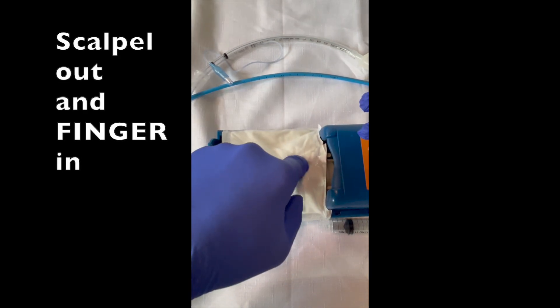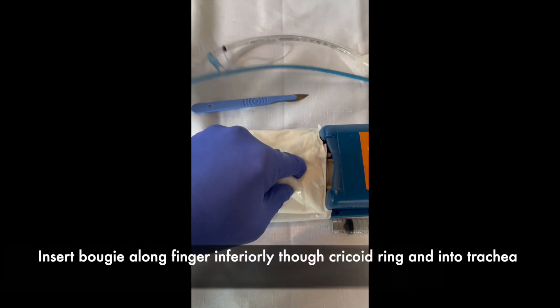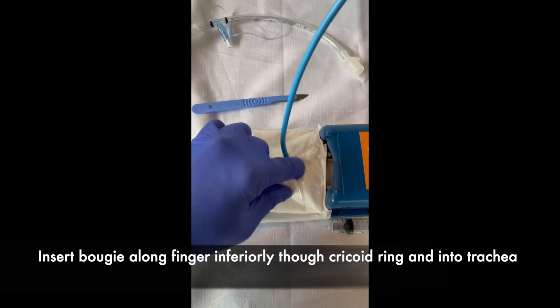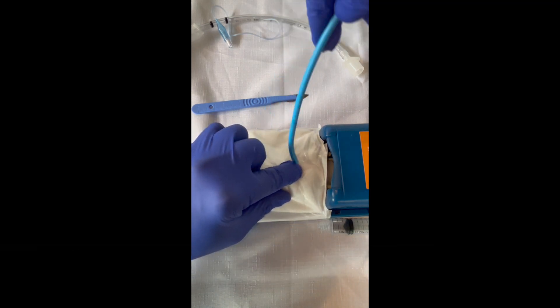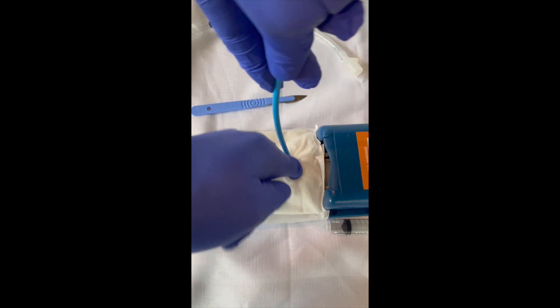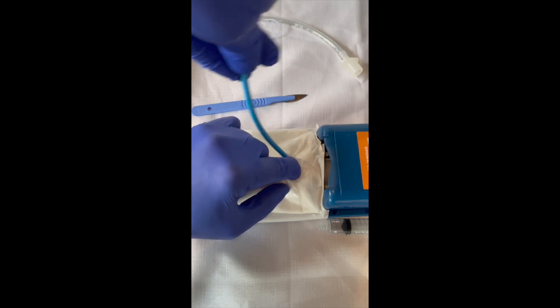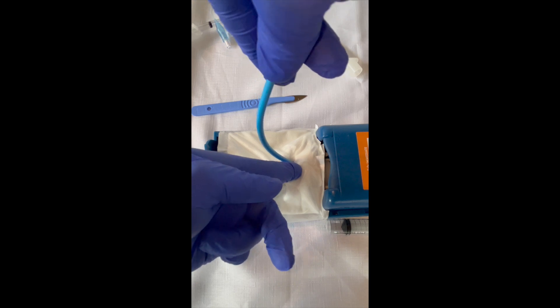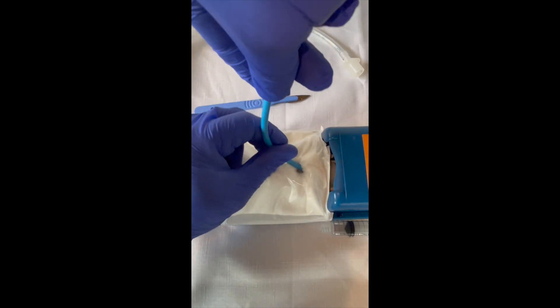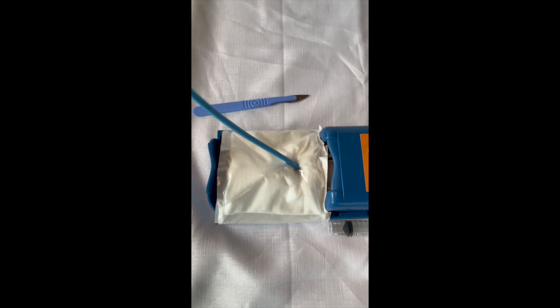We're very happy that we're in the right place now. So we can grab our bougie. The bougie goes in alongside our finger. We can confirm that the finger is still in the right space and the bougie is going down easily. I can feel it going down inferiorly.